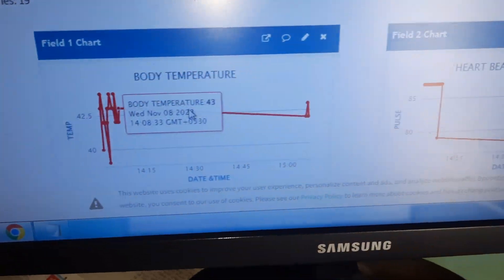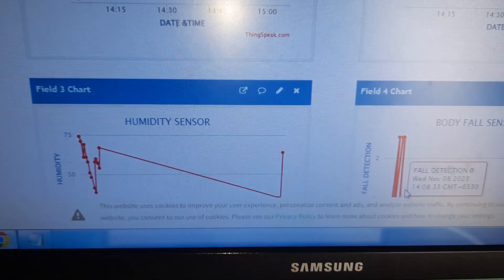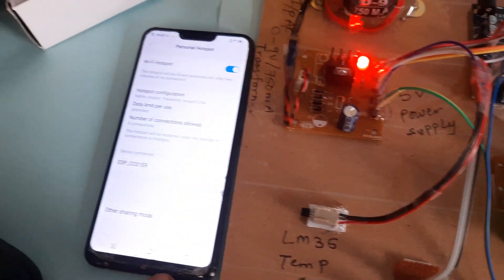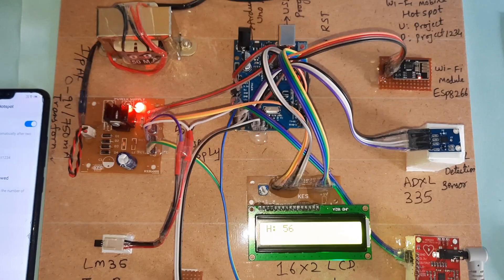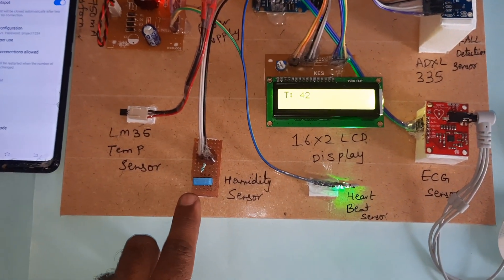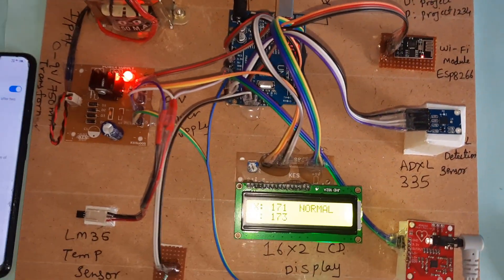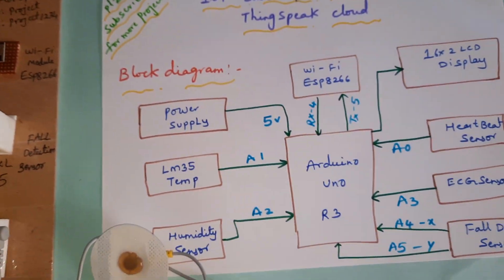All parameters — temperature, heartbeat, humidity, fall detection, and ECG — have been tested and are updating. Using this WiFi ESP8266 module with mobile hotspot internet, each parameter's data is sent over the internet to ThingSpeak. The ECG module connects to the body, and this is the block diagram of the project.